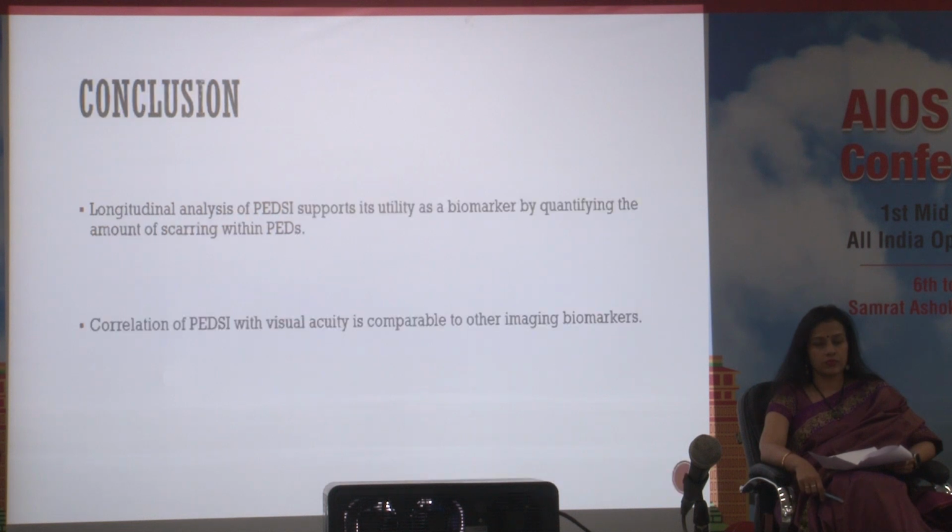Just to conclude, this longitudinal analysis of PEDSI supports its utility as a biomarker by quantifying the amount of scarring within the PEDs, and the correlation of PEDSI with visual acuity is comparable to the other imaging biomarkers such as CMT and SFCT.